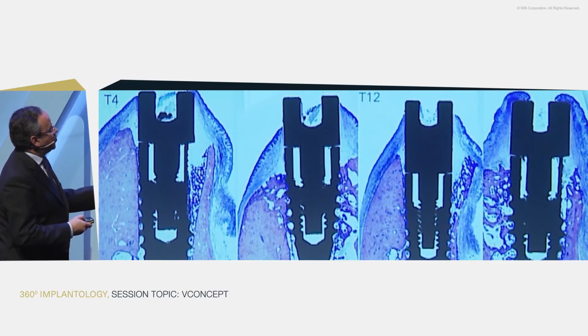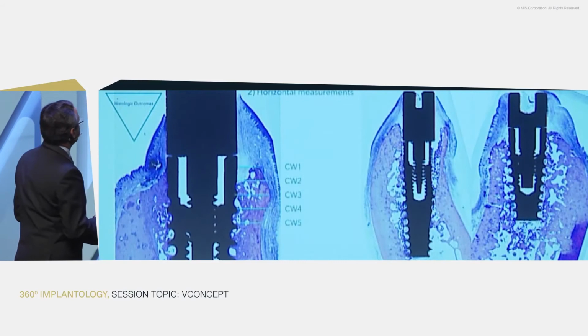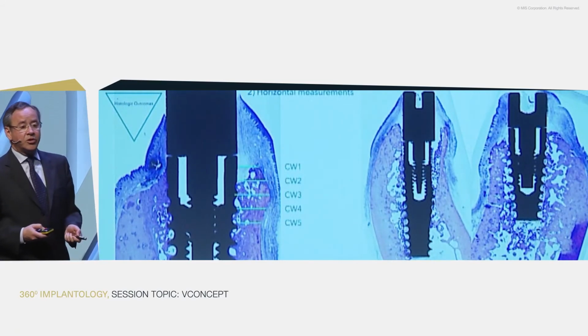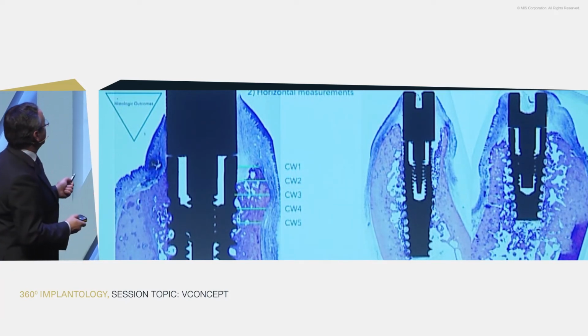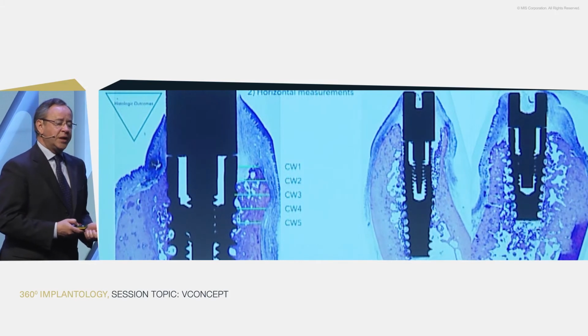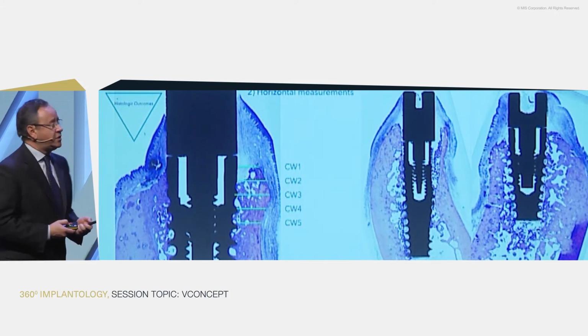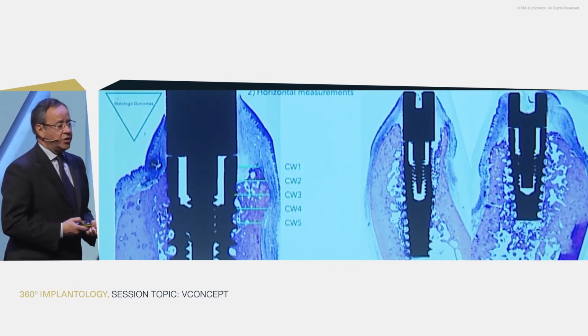And you can see how we measure, of course, from the gingival margin to the first contact, and then we divided what is epithelium and what is connective tissue contact. But probably the most important of the measurements that we are going to deliver to you are the horizontal measurements, because this new implant design was meant to augment the amount of bone buccally to the implant.